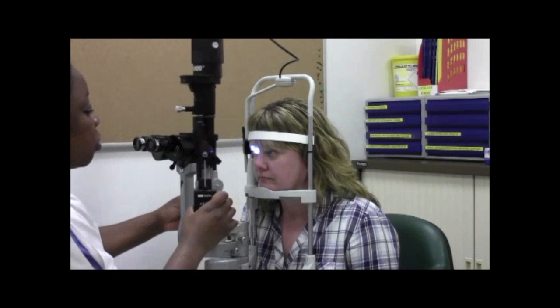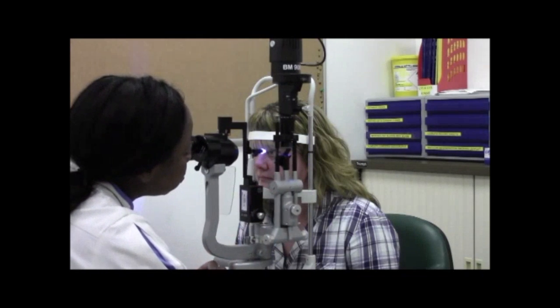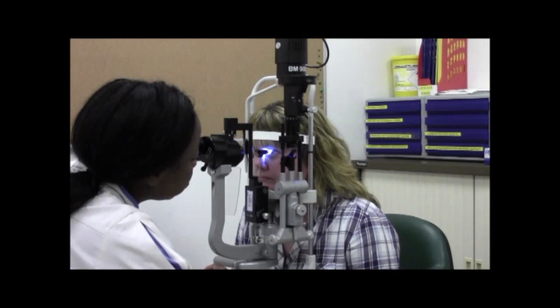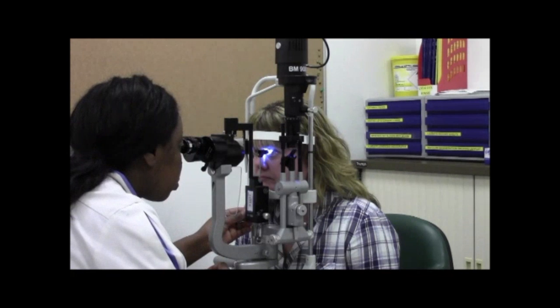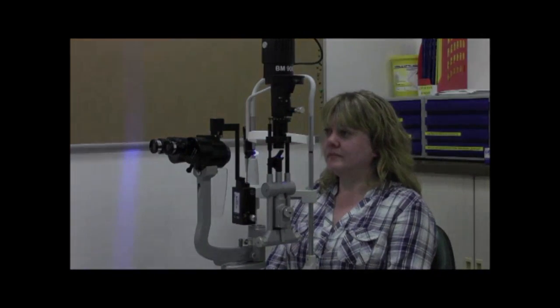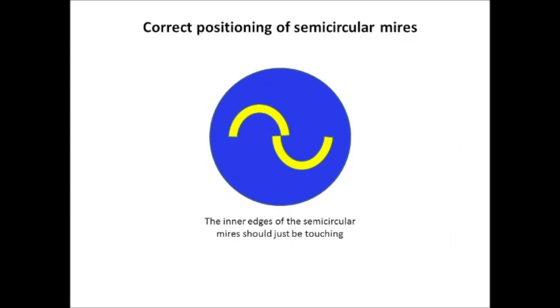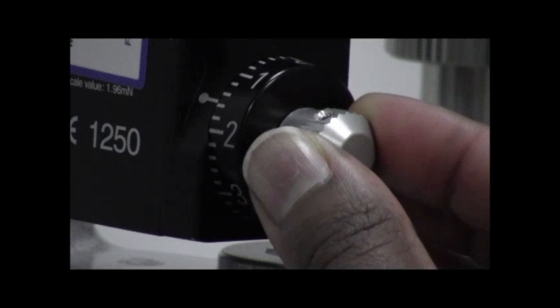Ask the patient to look straight ahead with their eyes wide open. Move the tonometer gently and slowly towards the patient's cornea until touching the central surface. If patients are having difficulty keeping their eyes open, you may assist by gently holding their lids. Avoid pressing on the patient's eyeball as this can give a falsely high IOP reading. Look through the eyepieces until the two fluorescent mires are visible. To ensure a correct reading, the mires should be of the precise width. Turn the measuring knob until the mires are just touching, and at this point you can record the IOP value.